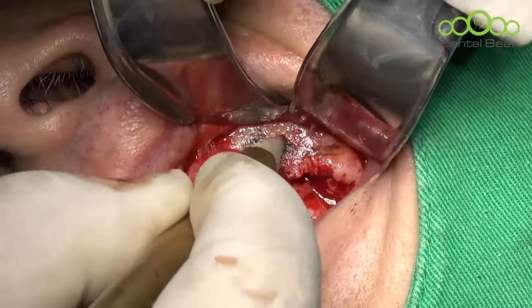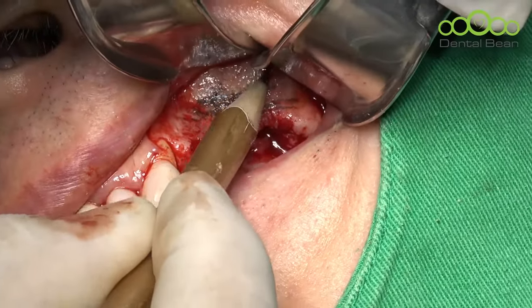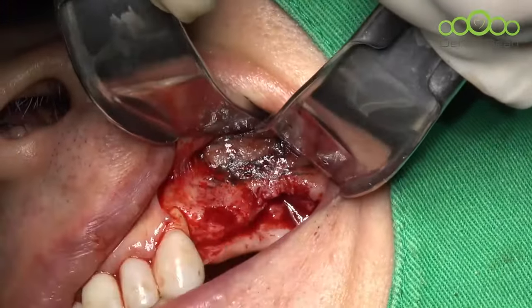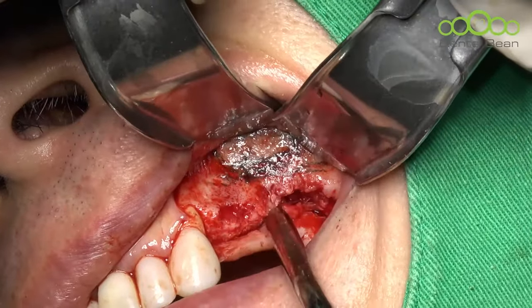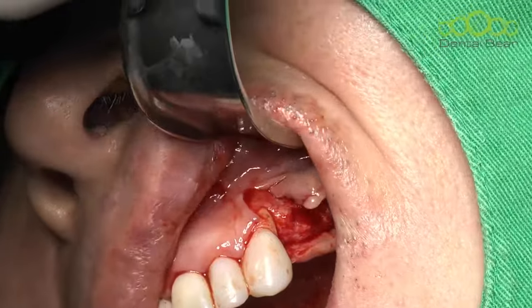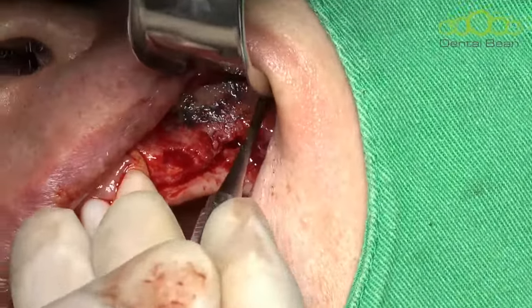Just slide over the floor. And like this. Okay. I will make the window like this. Because of less incision, it is difficult to retract the flap.